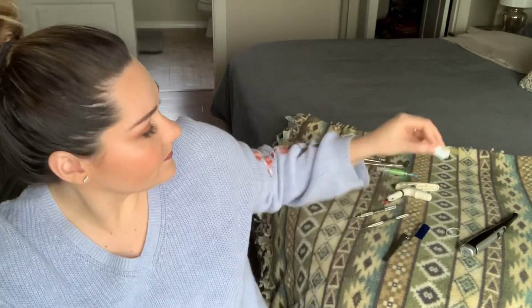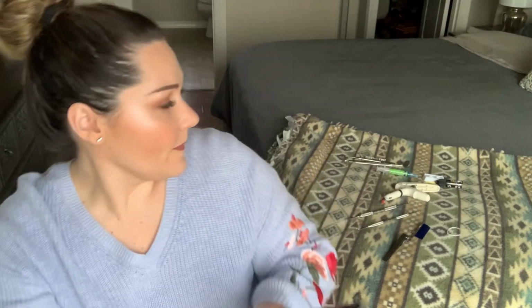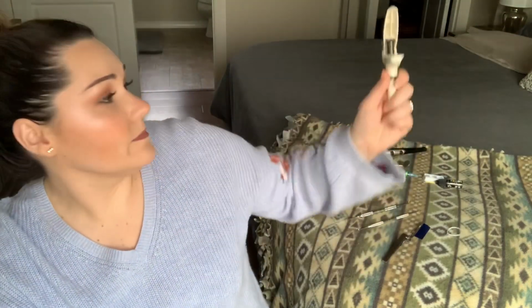And then some doctors like to spray a little air after they apply the bond, some don't, but you're going to apply the bond, the dentist is, and then you're going to light cure it. All right, so then you cure it, the dental assistant does. You cure the bond, it takes 10 seconds, and then he's ready for the composite.